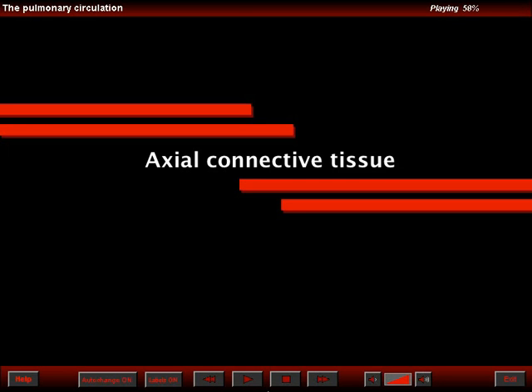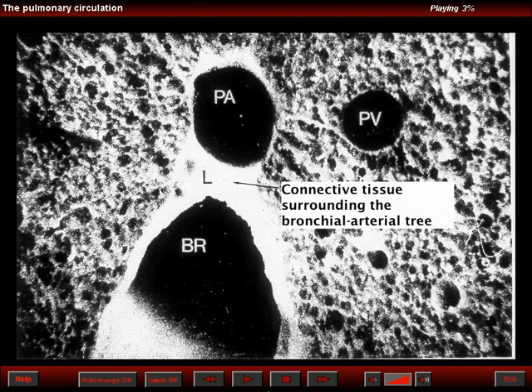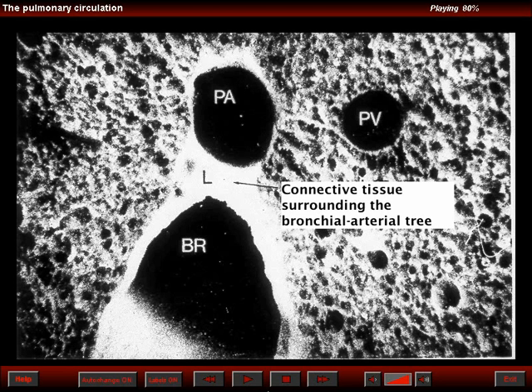We will now describe the axial connective tissue. This is a slide from Dr. Heitzman's collection which shows that in the walls of the bronchi and of the pulmonary arteries we see thick connective tissue. We do not see similar structures in the walls of the pulmonary veins. Therefore, if there is thickening of the walls of bronchi or increase in the thickness of the connective tissue centrally located, it represents the axial connective tissue which surrounds and accompanies the major airway and the central pulmonary arteries.